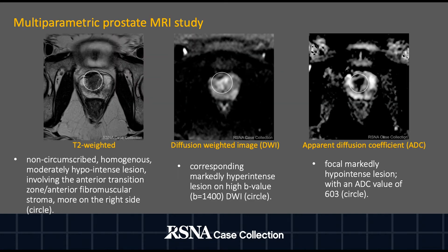Here we have axial images at the mid gland level from a multi-parametric MRI of the prostate. This is a good way to view those images by linking the axial T2 weighted, high B value diffusion weighted, and apparent diffusion coefficient or ADC map in adjacent windows.